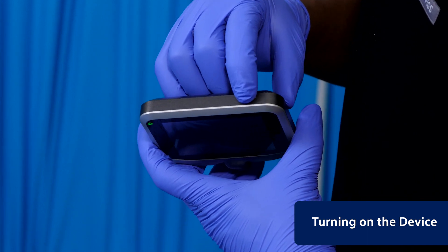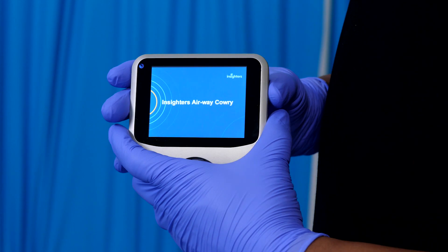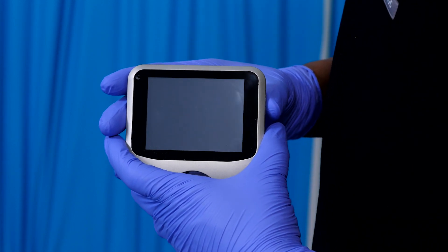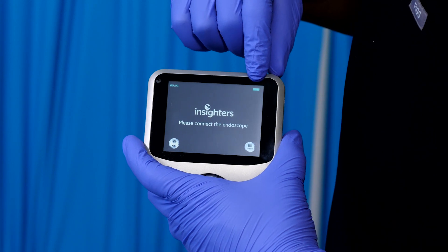Press the power button on the screen to turn on the device. Check that the battery is sufficiently charged.